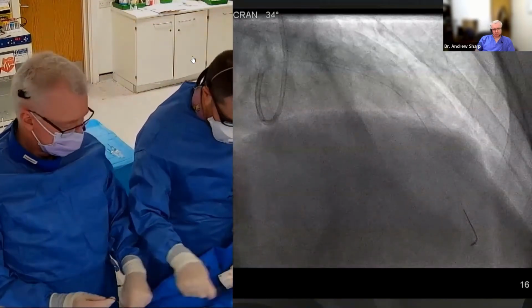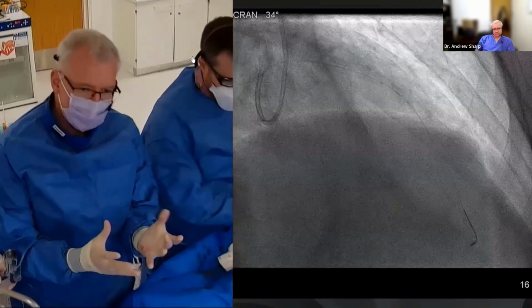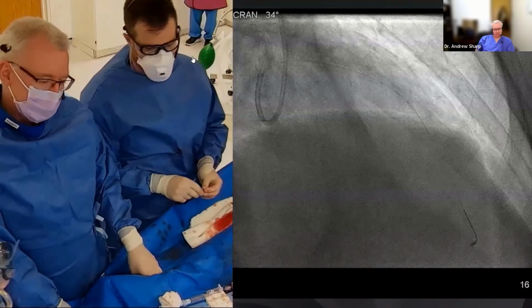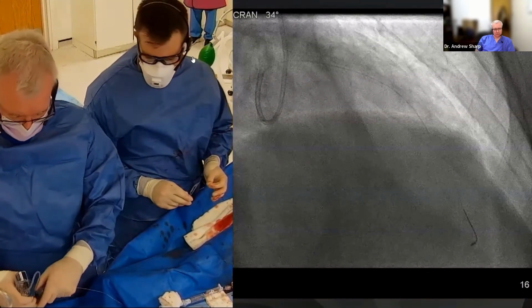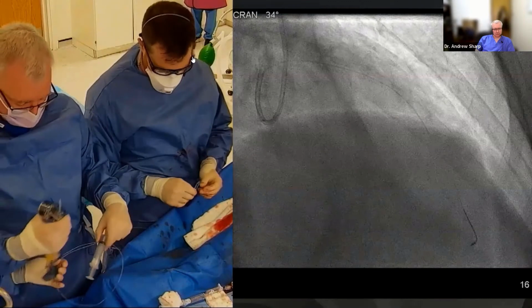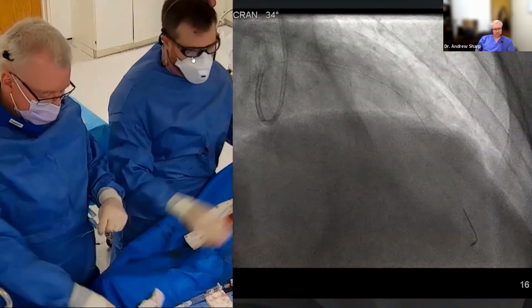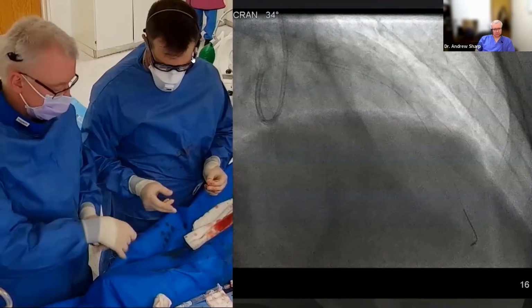And then a 4.5 by 6, please. Yeah. So if we're putting that proximal stent on the wall, we don't need high pressure. We just need to, in that case, go more diameter because it's not an under-expanded stent, in the sense that it's being restricted by the lesion. It's just that the balloon we've used isn't big enough to put the stent on the wall.